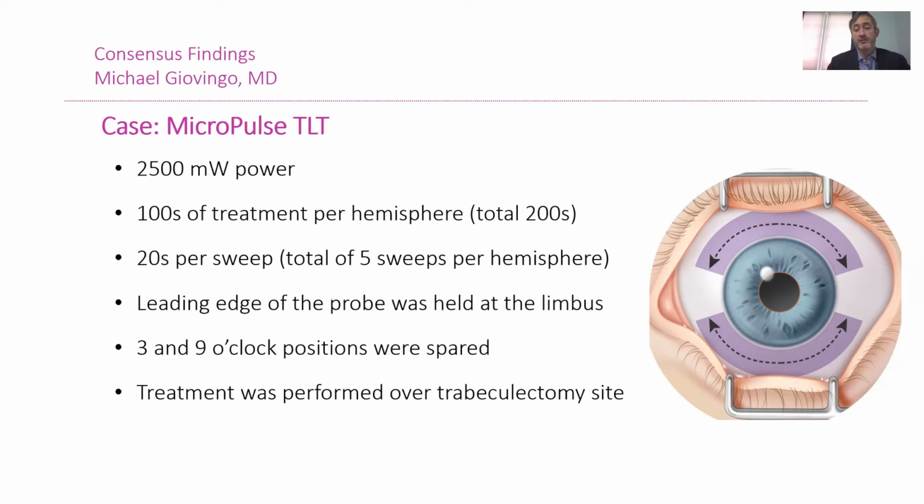I did treat over the trabeculectomy site, which I think for the most part everyone here has been in agreement on. When the bleb looks failed, low lying, it's important to still treat over the area to get as much treatment area as you can possibly get.